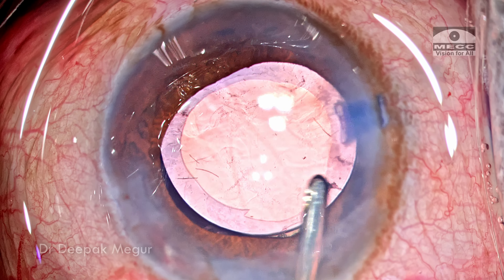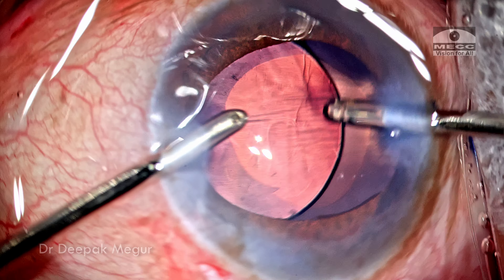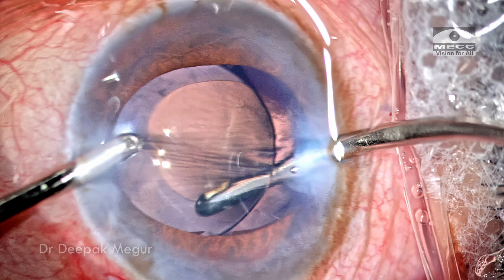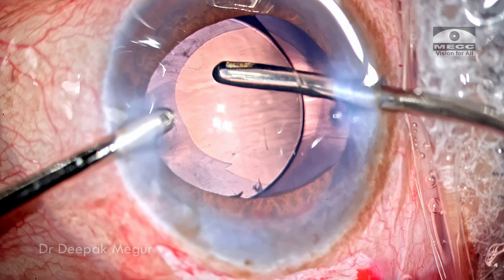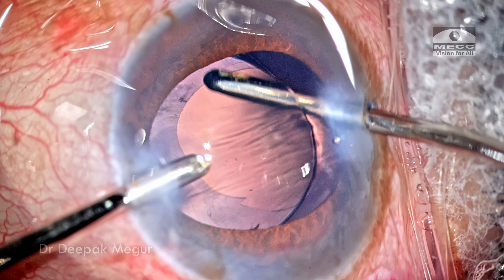I'm going in with the irrigation cannula to remove all the OVD in front of the lens. The lens is tilted and the irrigating handpiece goes underneath the lens, then irrigates out all the OVD from the back surface of the IOL and also from the capsule bag.